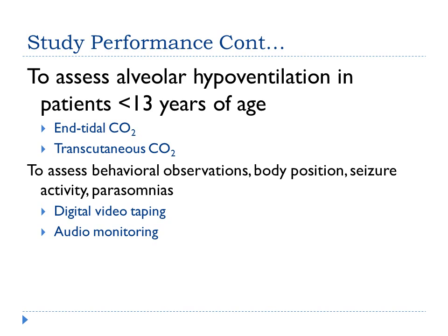With our sleep disordered breathing, to assess alveolar hypoventilation in patients less than 13 years of age, we do use end-tidal CO2 monitoring or transcutaneous CO2. This is a recommendation by the AASM. To assess behavioral observations, body positions, seizure activity, and parasomnias, we need to include digital video recording and audio monitoring. However, above all, one of the most important aspects of pediatric polysomnograms is the technologist documentation. Anything you see, even though it is being videotaped, you want to be able to document to keep a record. Let's go on to our next slide.